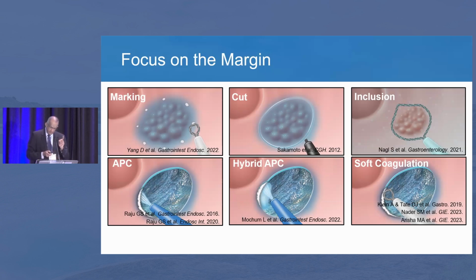And the second one is, although I cannot prove it, I do all my procedures under general anesthesia. Sometimes the patient is paralyzed, so that I have a stable operating field. That is probably helping me to have a good resection, examine the margin well, and cut down the recurrence rates. So that is something important to keep in mind.